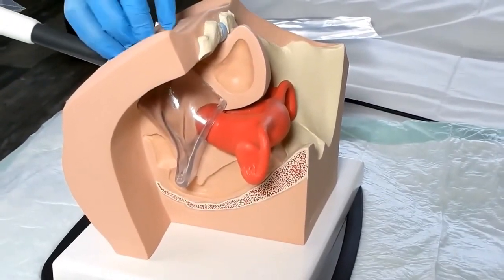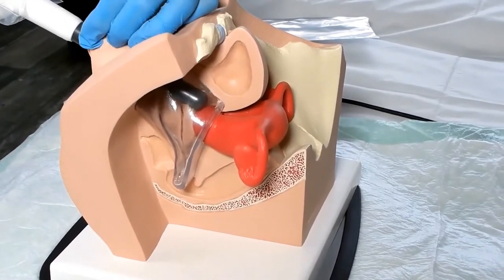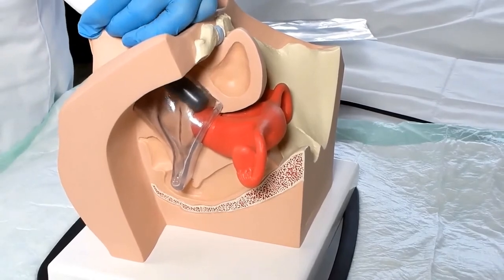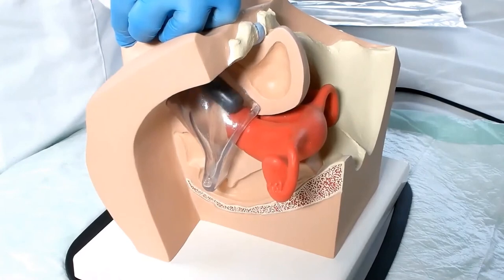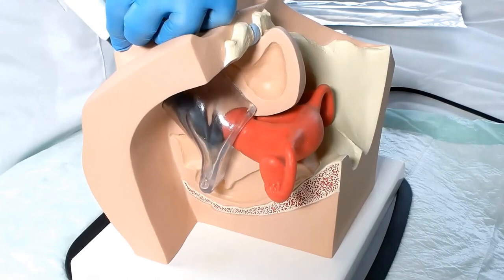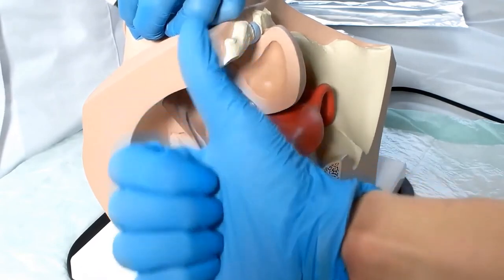With the device in pause, insert the electrode completely into the vagina. This is the correct way of application: make a slow and continuous back and forth movement on the vagina wall without stopping.